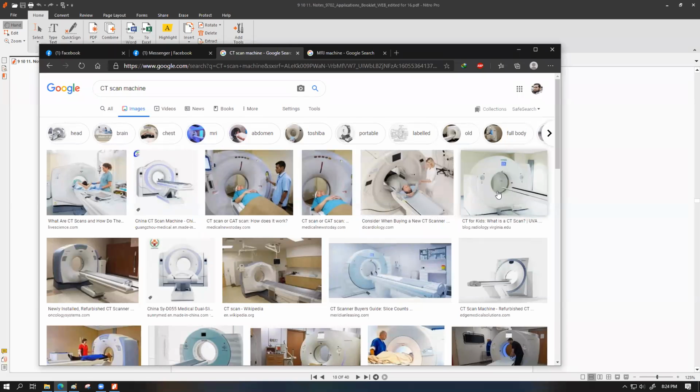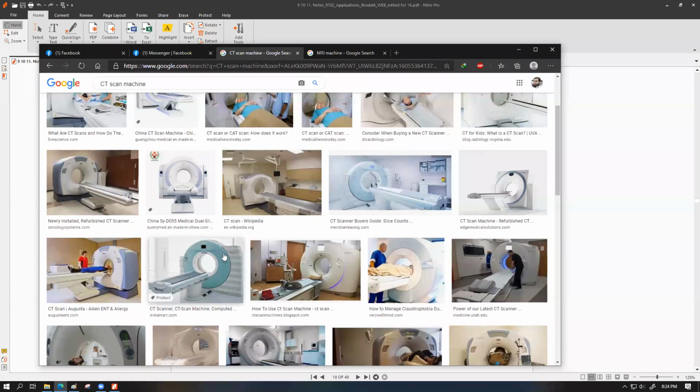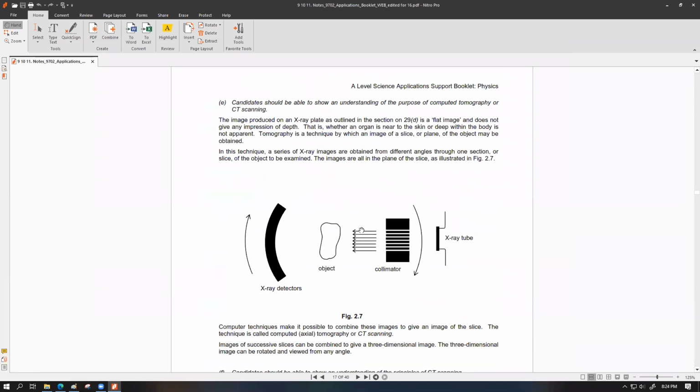What is also important is that within this device, this donut-shaped thing, we have the X-ray sender and X-ray receiver, something that is shown over in this place. The patient is kept stationary because we don't want to cause discomfort.